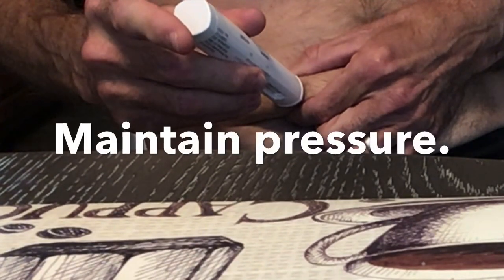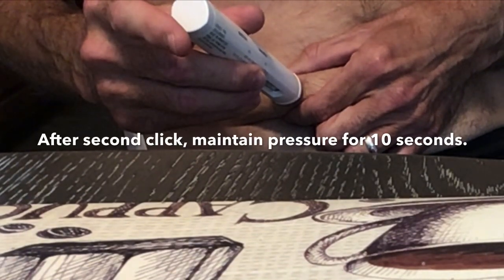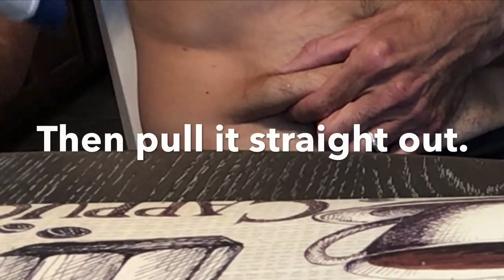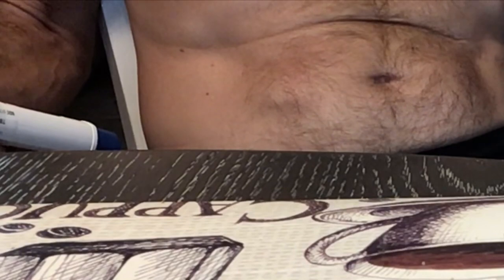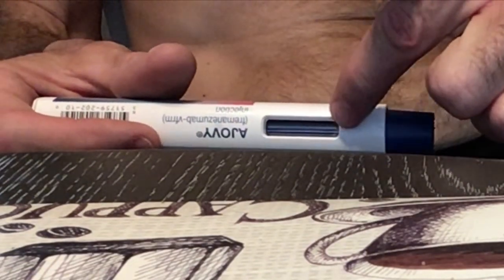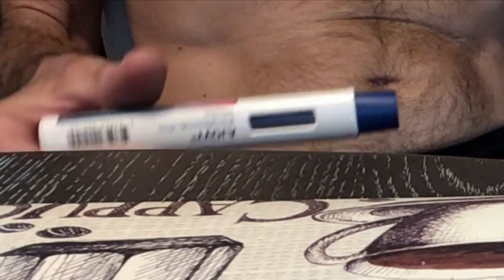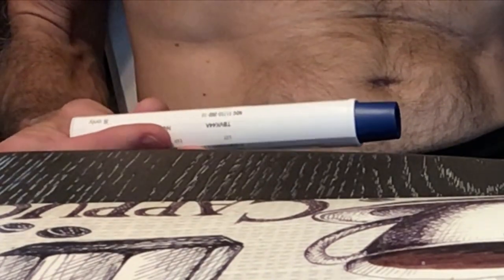One, two, three — and there it is. A little tiny hole you can see right there. The little blue thing here means that it injected everything. You have to sit there and let it — about 15 seconds after the second click, let it sit there, around 10 seconds, and let it finish injecting the medicine.